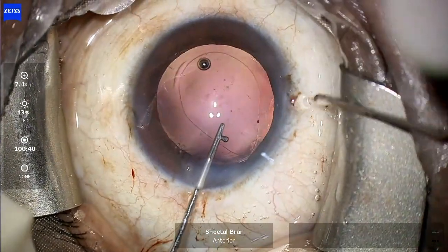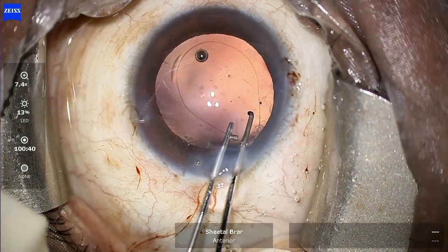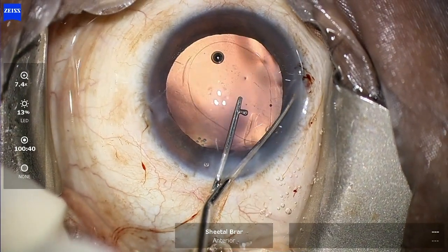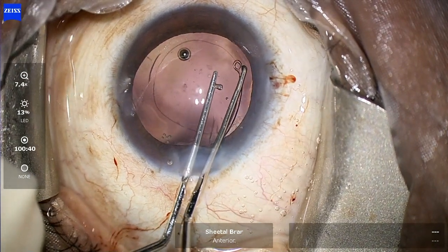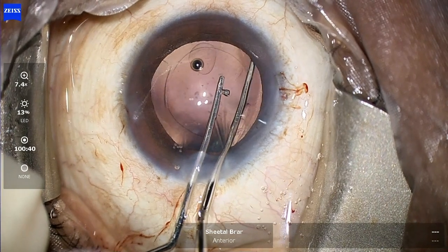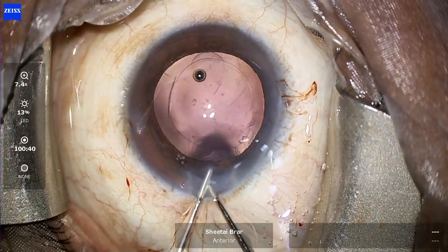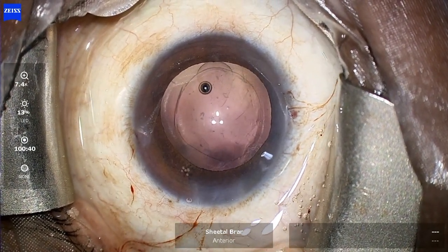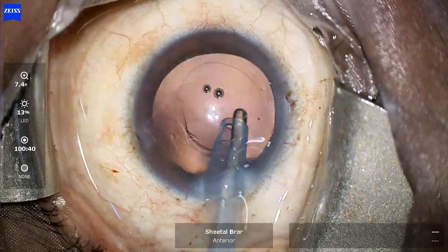However, the CTR slips suddenly and goes above the capsulotomy, as can be seen — the capsulotomy is peaking. I then go from my main port and, using a Sinski hook, gently retract the CTR towards the center and very carefully release it into the bag. This time I seem to be successful, as the capsulotomy has become absolutely round and the bag looks much more stable.